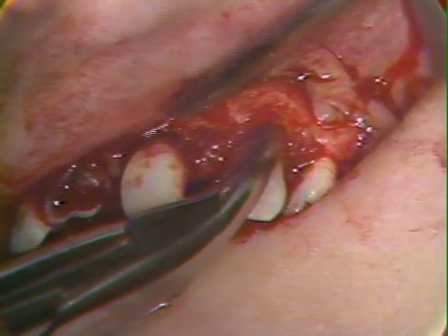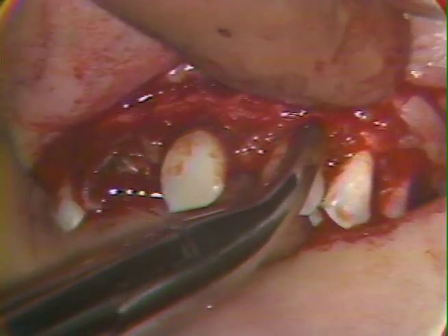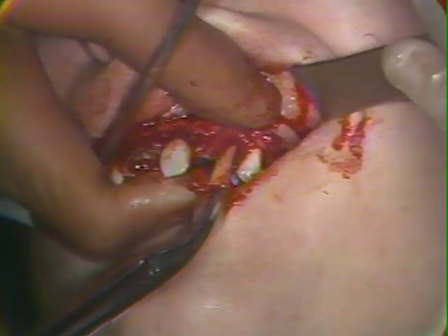Sometimes you can support the maxilla rather well here by grasping it in this manner, and in just giving a little rotation to that, we see the length of the cuspid root that was delivered, and also the conservation of the bone. No bone fracture. We want to avoid fracture of the bone.